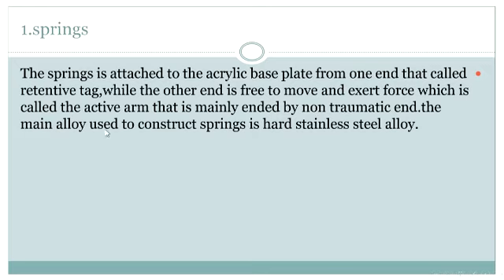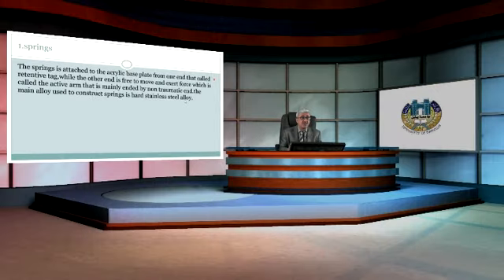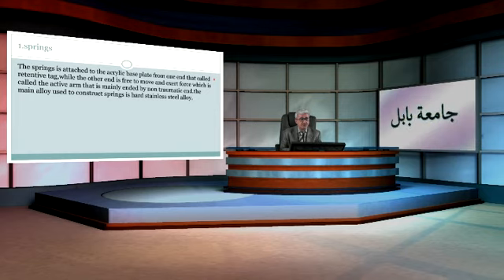The main alloy used for constructing springs is a hard stainless steel alloy with different ratios of chromium and nickel, which is suitable for tooth movement.